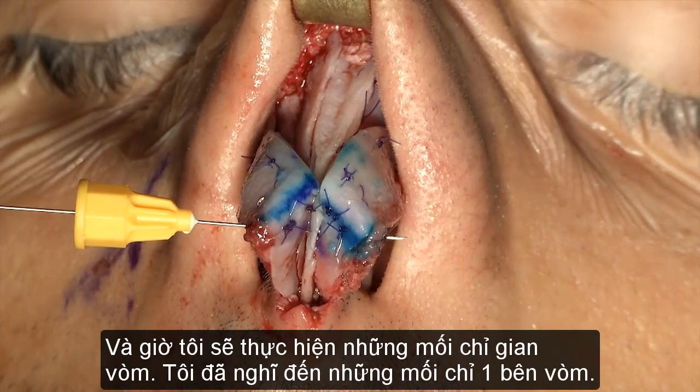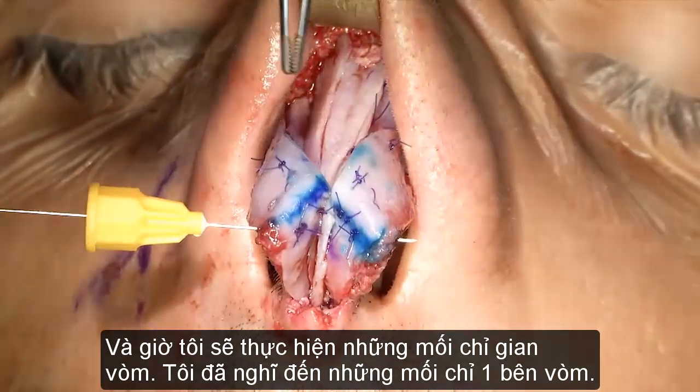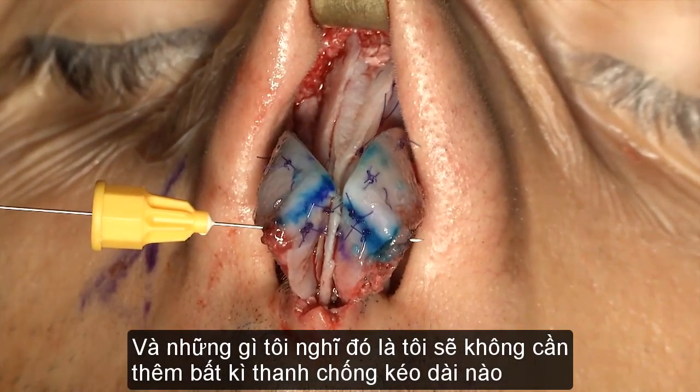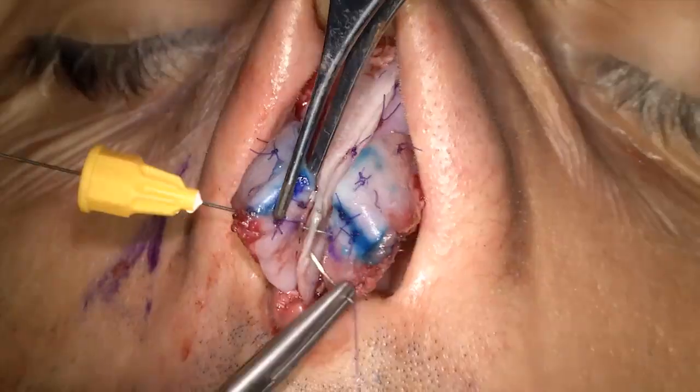So I did the transdomal suture. I'm kind of thinking of an interdomal stitch. And what I am pleased to notice is that I don't need any septal extension graft, since that septum is just tall enough.